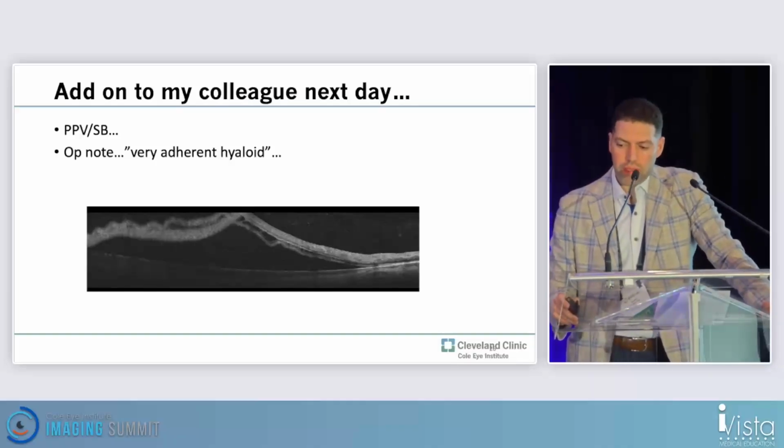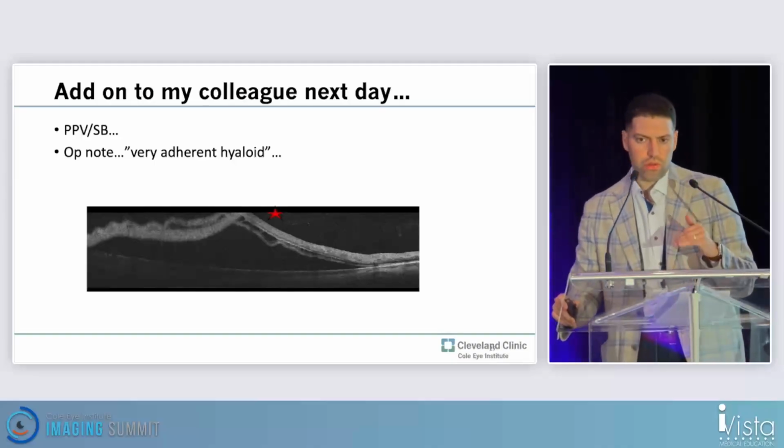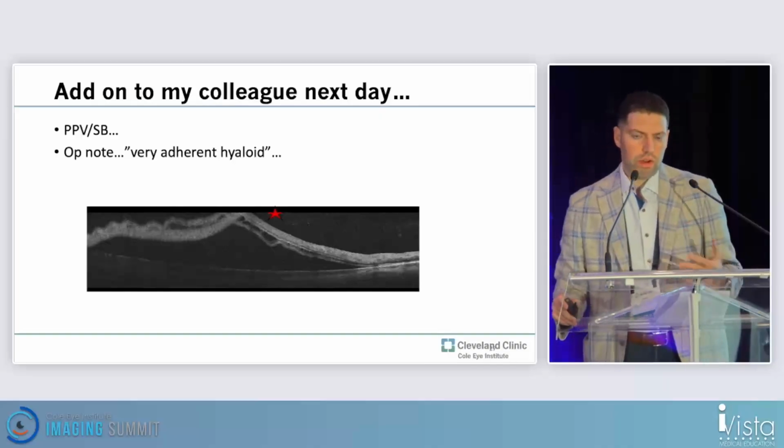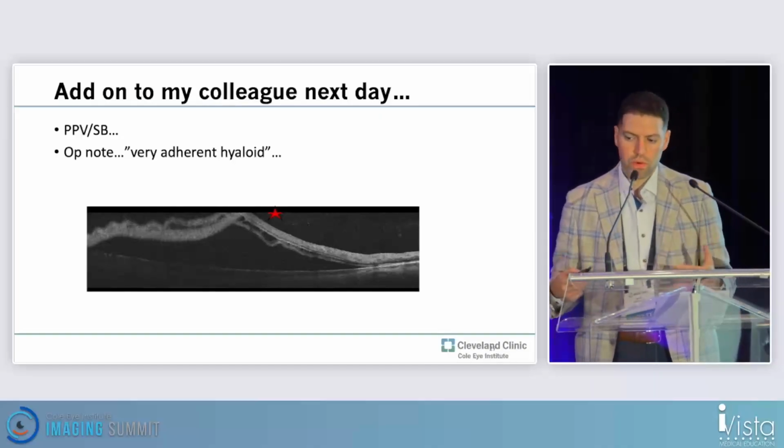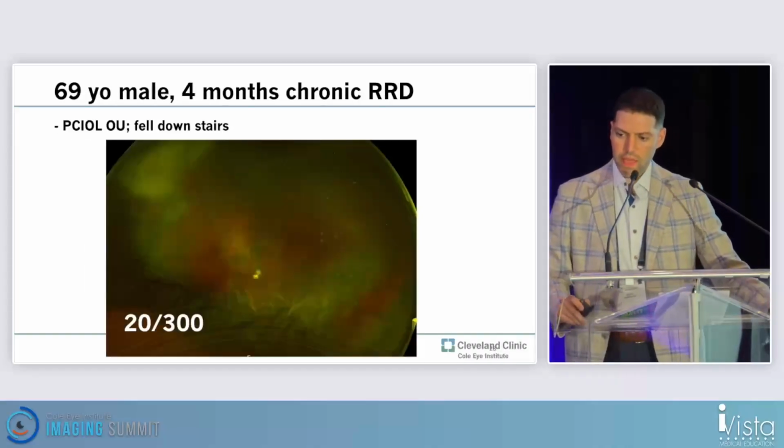So going back and trying to always analyze what went wrong, if you look closely, you can see the premacular bursa space there, and if you scroll through, it becomes a little bit more obvious. We're very busy in our clinics, though, so it's really important to train yourself very well to recognize these things.